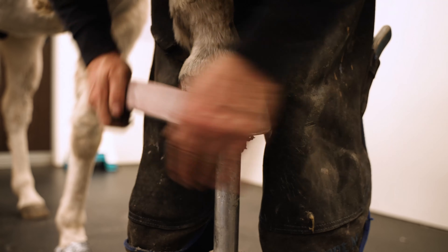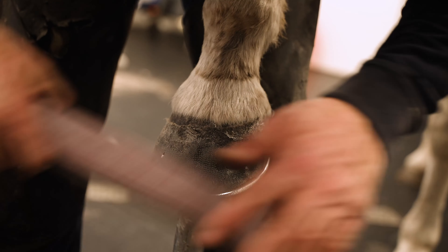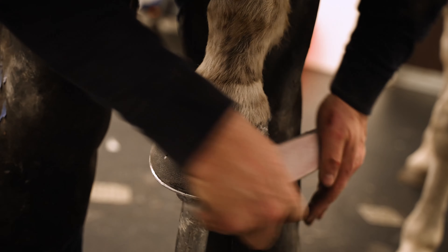We recommend using a knife or cast cutters, being careful around the bulbs and coronary band. The shoe can now be nailed on and clenched as usual.